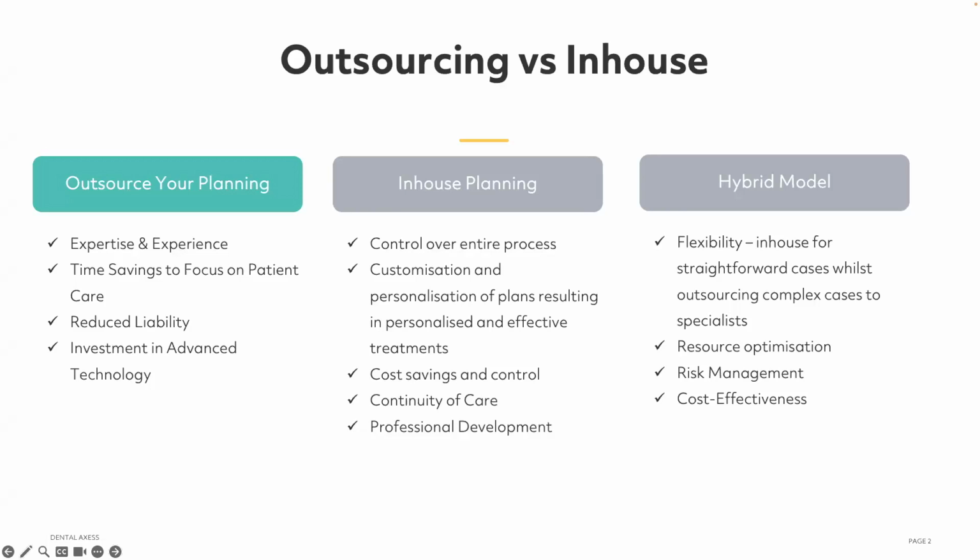This approach involves relying on external specialists or treatment planning companies to design your clear aligner treatments, especially when you have cases requiring extensive tooth movement, complex bite alignment issues, and patients with unique dental conditions. Now, the benefits of outsourcing usually include being able to leverage the expertise and experience of specialists, just like Dr. Tania, reducing the burden on your own capacity, in-house resources and staff, the ability to handle complex cases efficiently, and also access to advanced technology and specialized expertise.